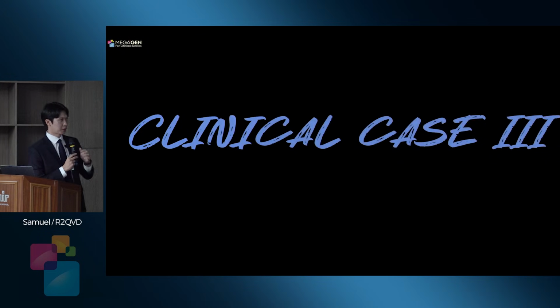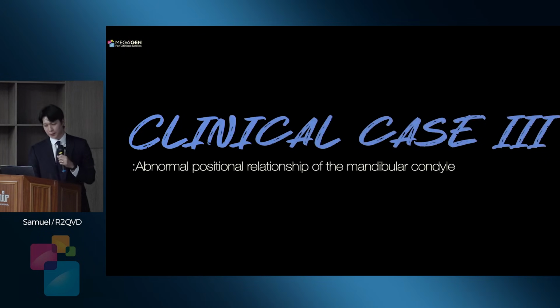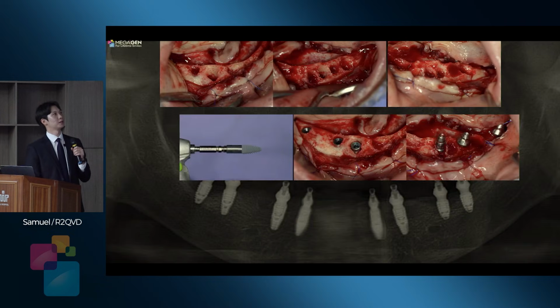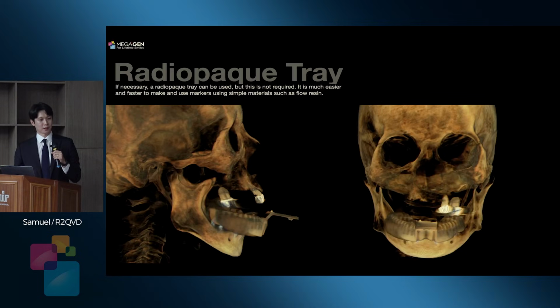And number 3 case, yes, clinical case 3 is this. It's a more complicated case, but the same way, Dr. Park did the surgery. Actually, it was almost the first time when we made this case, we were just trying QVD, and Dr. Park wanted to make this kind of solution. Without wax rim, we want to make a VD with the software.